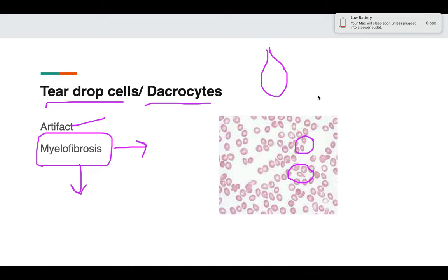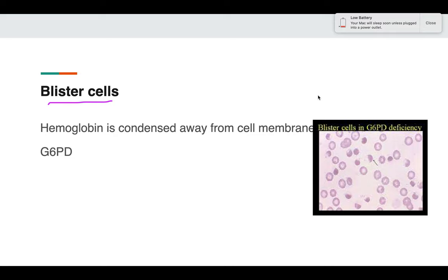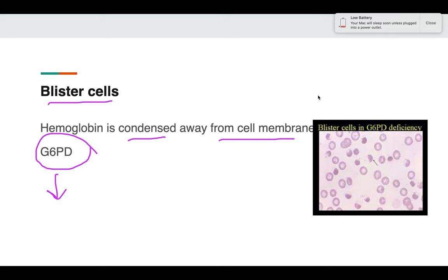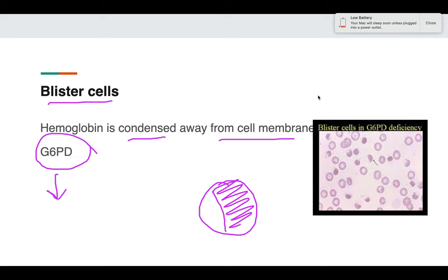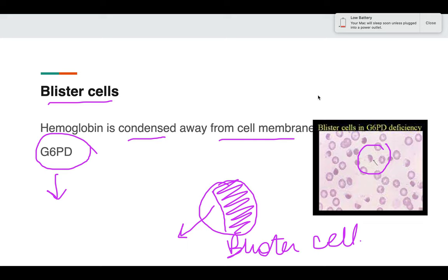Blister cells are seen in G6PD deficiency. In G6PD deficiency, the hemoglobin gets condensed away from the cell membrane — so part of the cell is stained and part is not stained; this is known as the blister cell. You can see approximately half the portion is stained and half is not. These are seen only in G6PD deficiency.